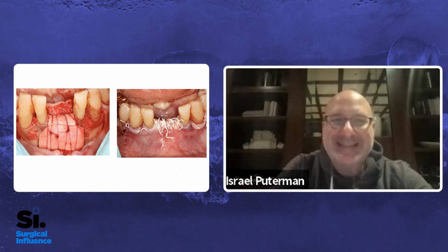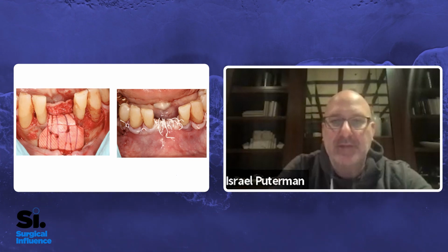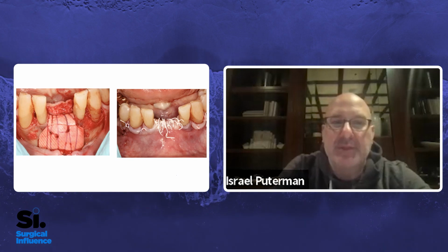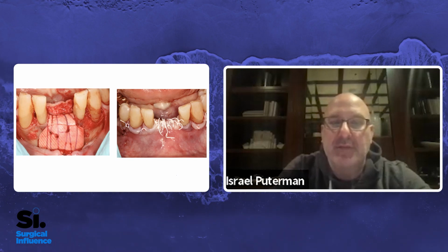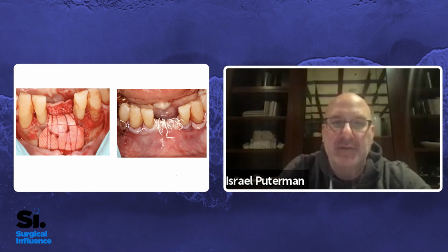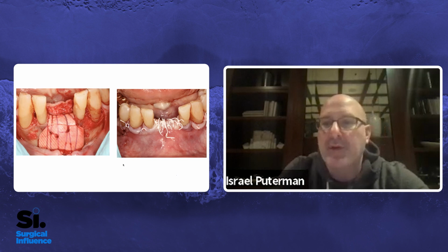Yeah, you definitely need something non-resorbable, or something that'll give you much more physical support, so you won't have collapse of the defect that you get more so with a vertical deficiency than a horizontal. Just gravity is going against you over here. So I love the combination of using resorbable materials, but still having that structural support of the tenting screw.